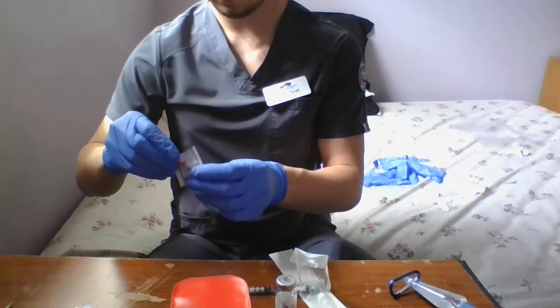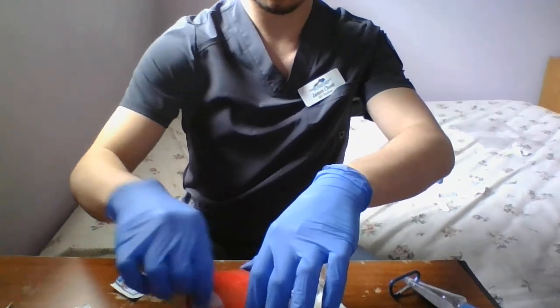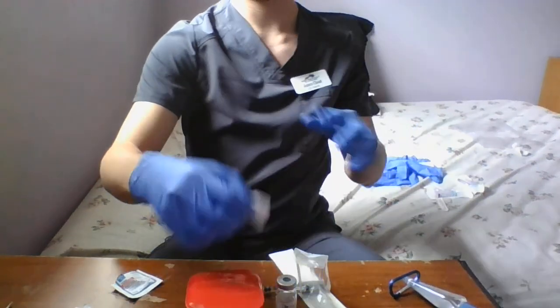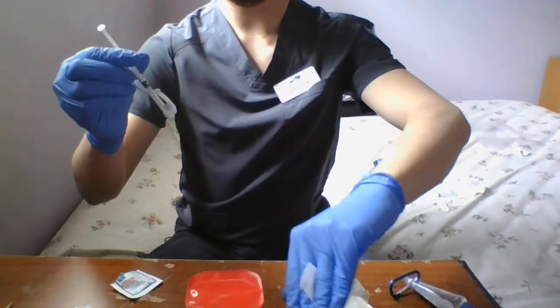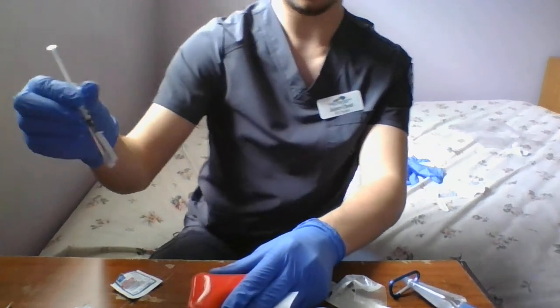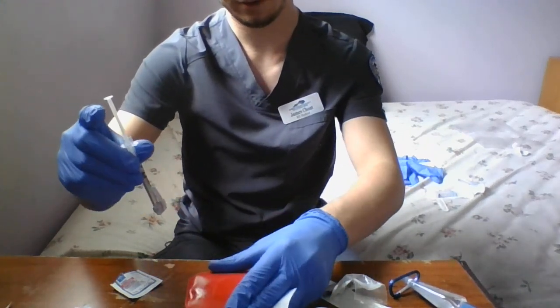Alright, so I'm going to clean the site with the pad again. Hold it between these fingers. This can be done at a 90 to 45 degree angle. For today's purposes, I'll be at 90. For subQ, you want to pinch the skin, and you don't want to go too deep, and you just want to make sure that you're getting that fat layer.